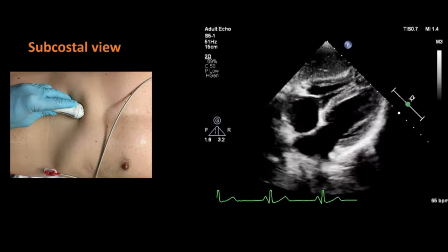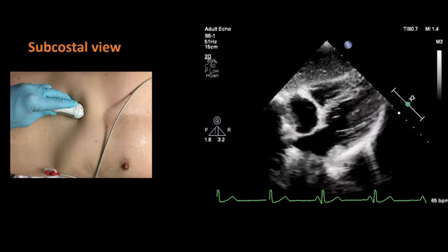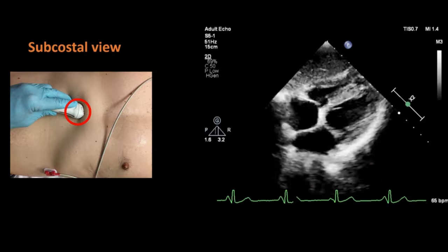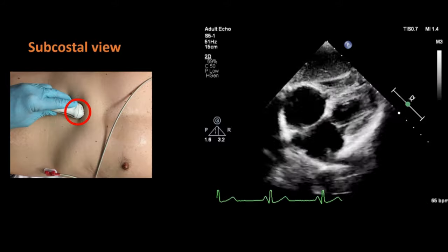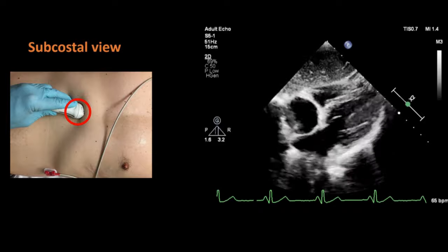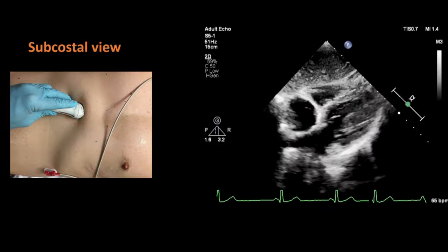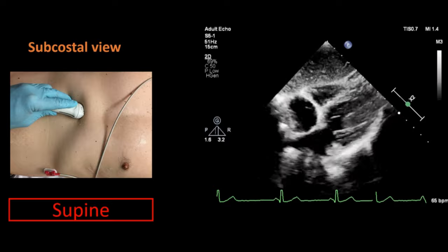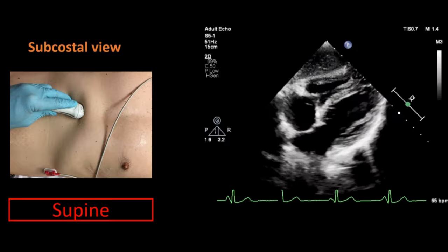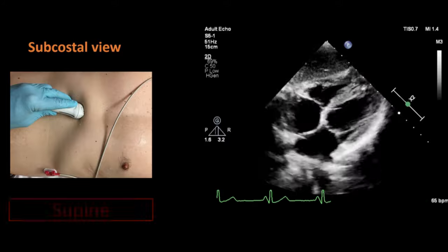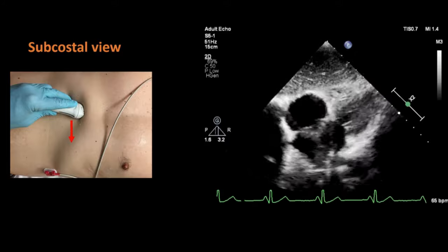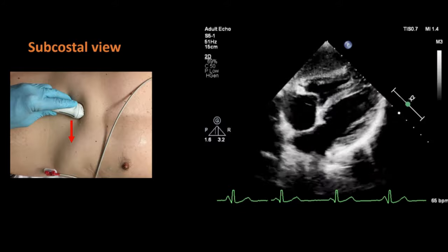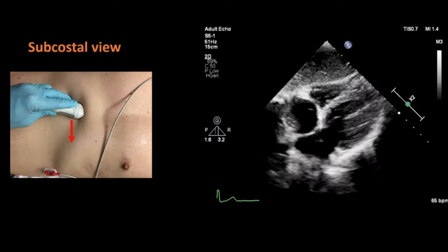For the subcostal view, the transducer probe is placed in the subxiphoid region, just below the lower part of the sternum, and is tilted anteriorly to focus on the heart. The patient will lie supine for this view. To obtain a 4-chamber view, tilt the probe anteriorly until you are able to focus on the heart, and keep the orientation marker towards the left side of the patient for easy identification of cardiac chambers.